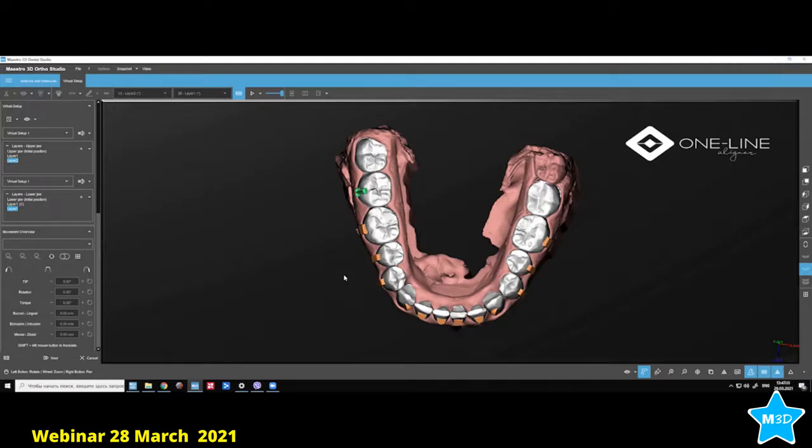Okay. Yes, this is one of the questions the dentist has asked. How do we respect the thickness in posterior less than anterior? If we don't need intrusion, we just take it with the burr. I think he will say to grind it out or something else. Okay, so I can read the question: how do we respect the thickness in posterior less than anterior if we don't need intrusion?